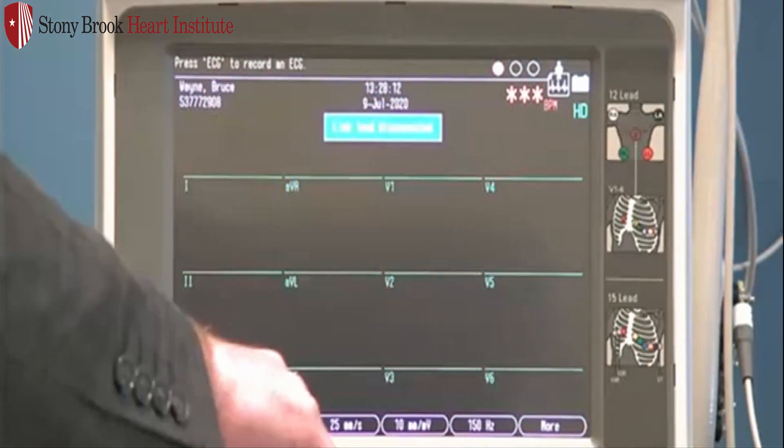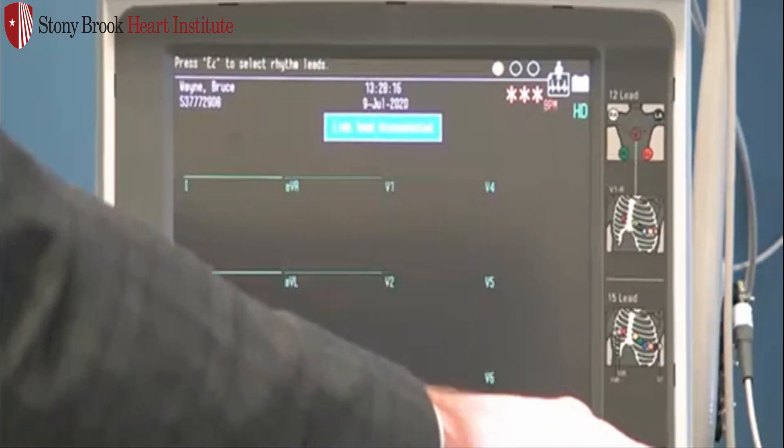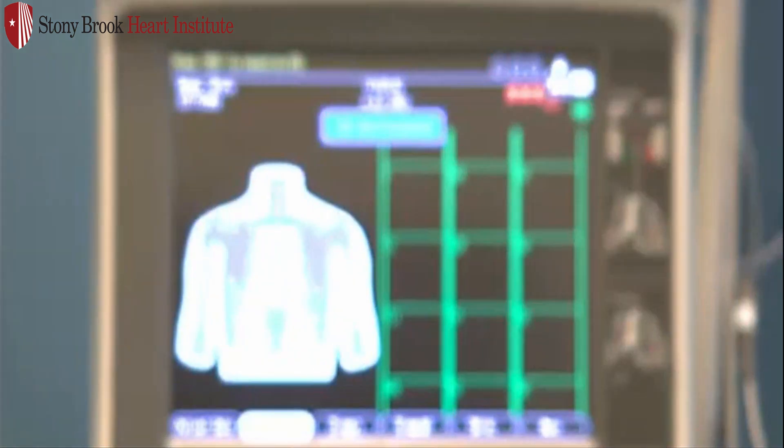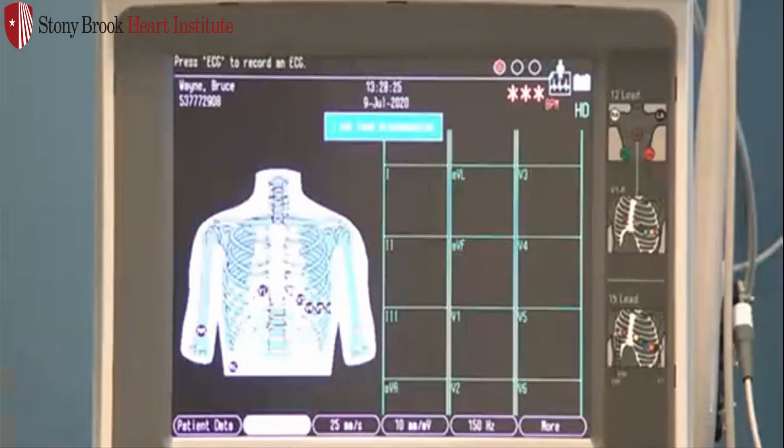One of the nice features: if I press F2, I can scroll down to my lead placement. This will give me my hookup advisor. What's nice about this is we have a green, yellow, or red quality indicator. We're searching for the green quality. You can acquire an ECG with a yellow quality; however, you may have some underlying baseline wander or artifact, which can interfere with the quality of the ECG. So always try to get a green quality hookup.